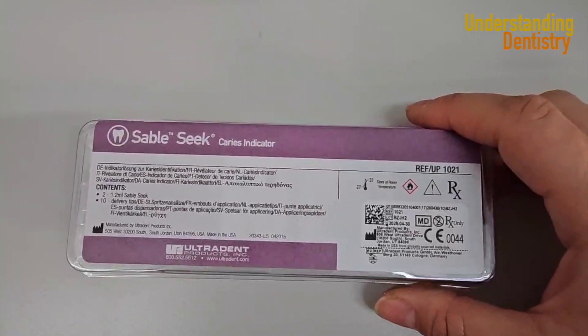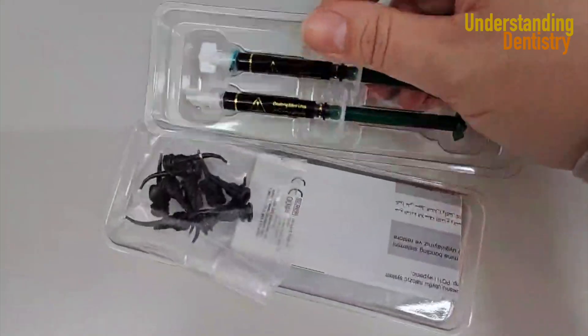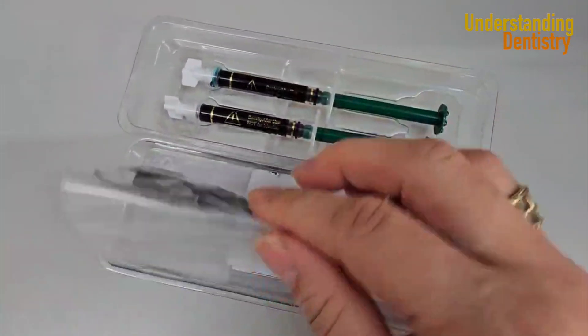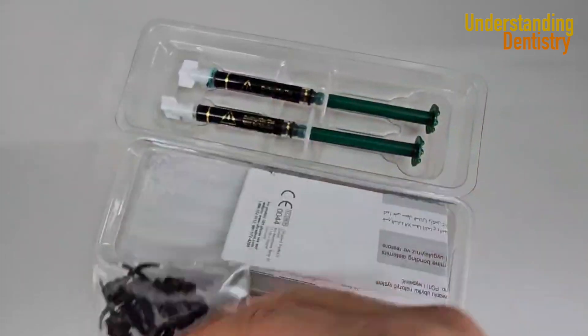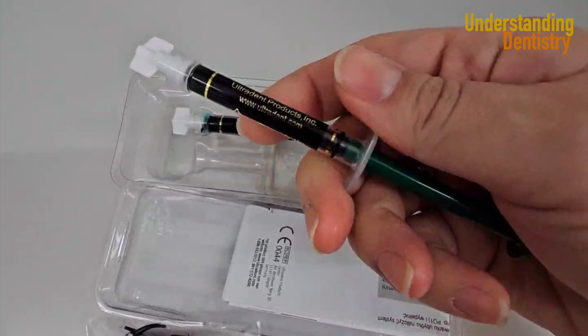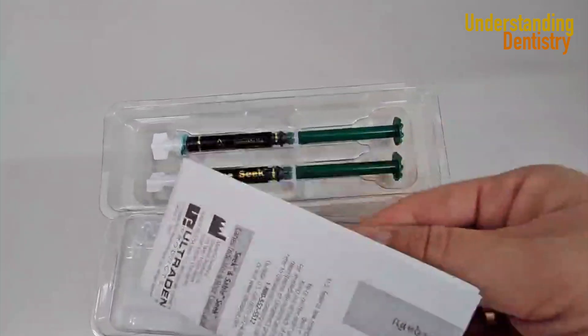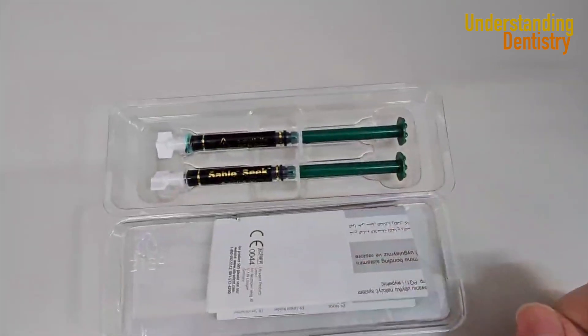We are unboxing the product to show you guys — there are the tips and the product. Those are brush tips and they are very useful. Please realize that this is a green product to differentiate from the red of the pulp chamber when you are close to the pulp chamber in cases of deep caries.